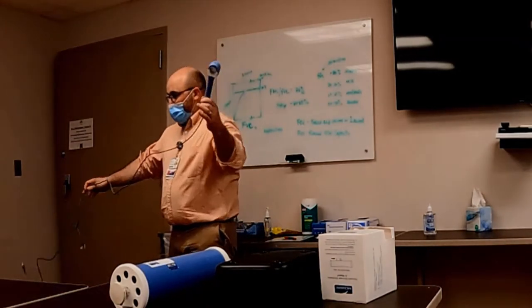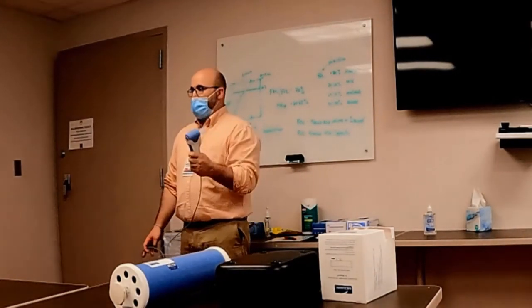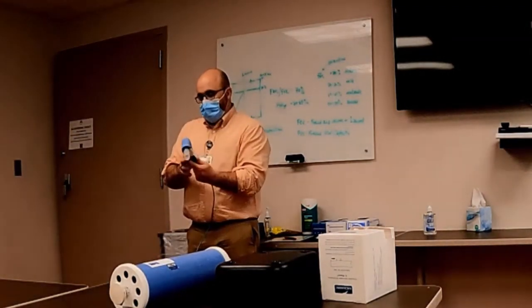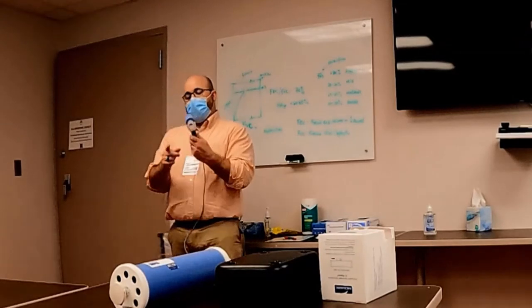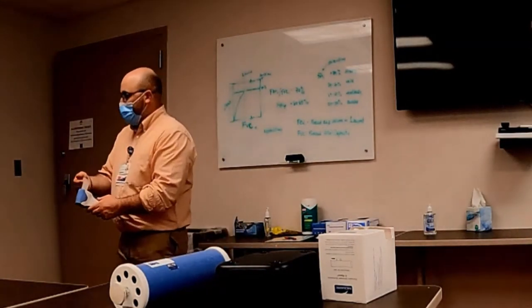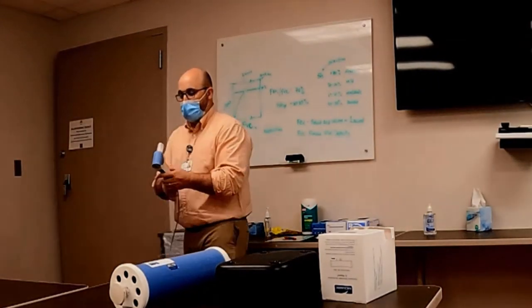The cool thing about this is you got some cord, so you're gonna let the patient hold it because they're gonna have to blow into it, and so they'll want to hold it. Now you'll also notice they made it short, so they couldn't blow on this side because this is the wrong side. And if you ever see these little ridges, that's for people's teeth, they kind of grab onto it if they have to.